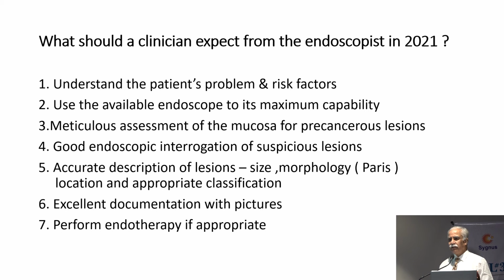Don't do that. Make sure that if you're doing an endoscopy, let it count. Have a patient who's fasting, sedate him, wash, and interrogate. Meticulously assess the mucosa for precancerous lesions.